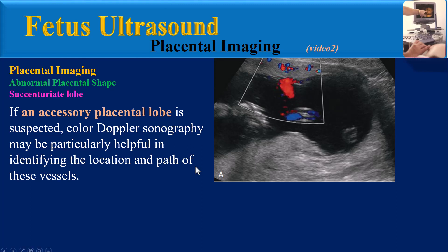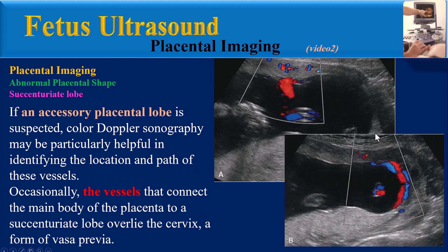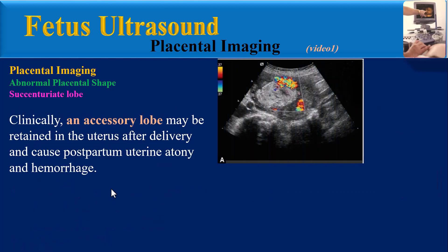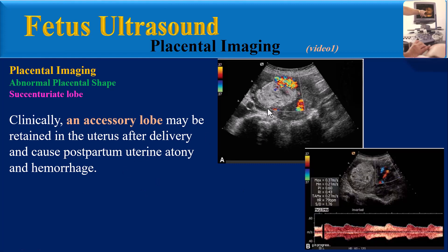Occasionally the vessels that connect the main body of the placenta to a succenturiate lobe overlie the cervix, which is a form of vasa previa. This color Doppler sonography shows vessels connecting the main portion of the placenta to the posterior succenturiate lobe. In this situation there is a risk of rupture of the vessels connecting the lobes during labor, which may lead to fetal death. Clinically, an accessory lobe may be retained in the uterus after delivery and cause postpartum uterine atony and hemorrhage.